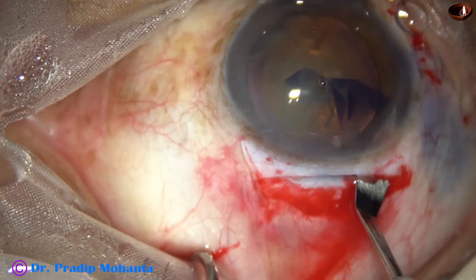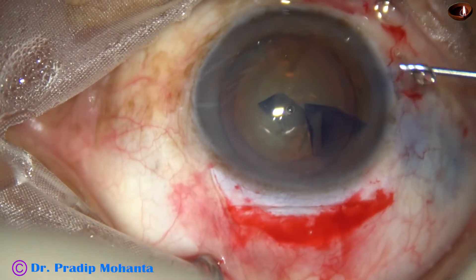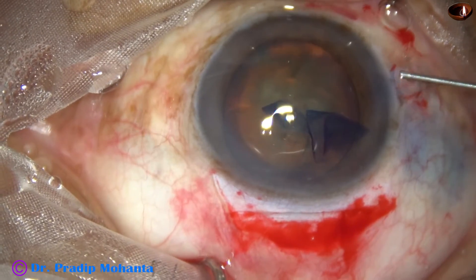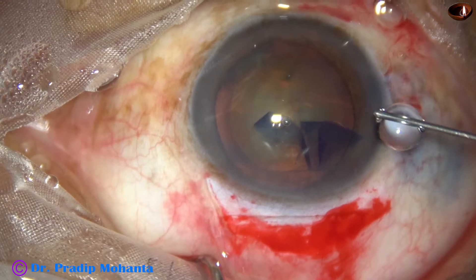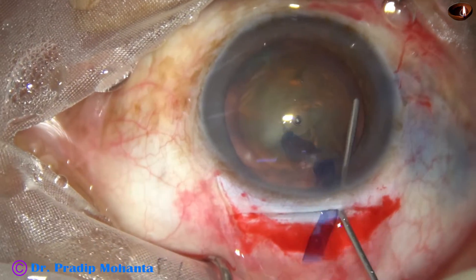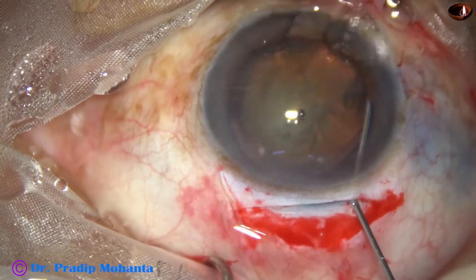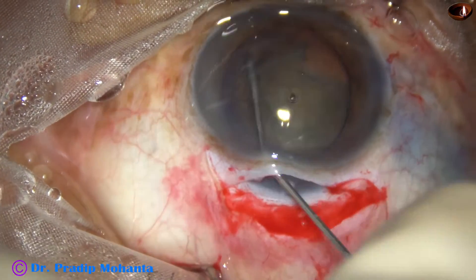The tunnel is now opened. Hydrodissection is done with Ringer's lactate or balanced salt solution. The nucleus is tapped and rotated to confirm it is freely mobile within the capsular bag.